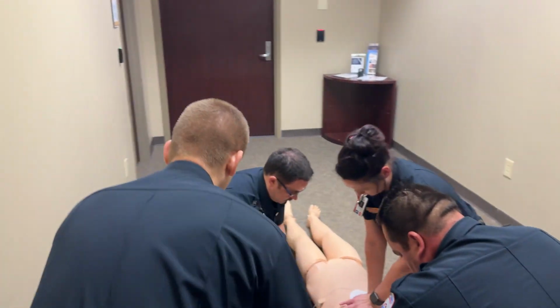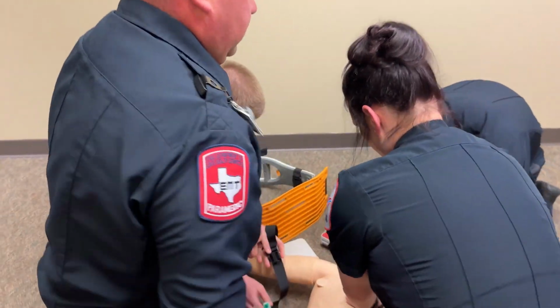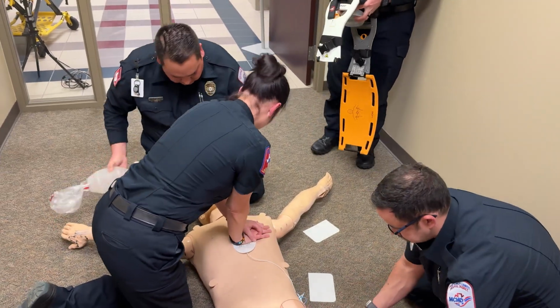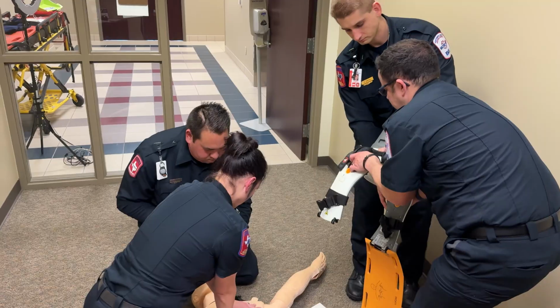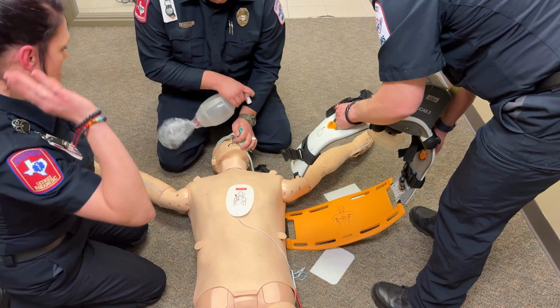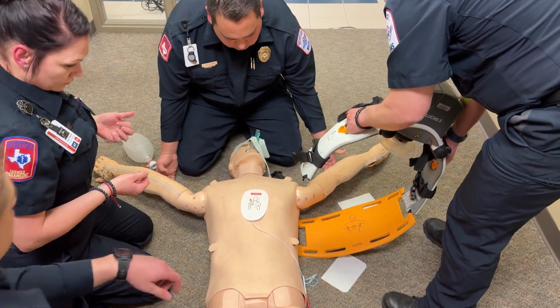If we practice this and you watch the seamless transitions here in the video, let that be a guide for us out in the field. Obviously, that's a sterile condition in a hallway here in the MCHD administration building, and we know that out in your worlds you run into situations that are much more difficult than this. But we can do this. We can make this Lucas transition seamless with short pauses and increase our CPR survival rates across the county.